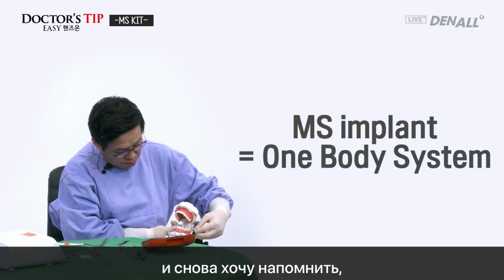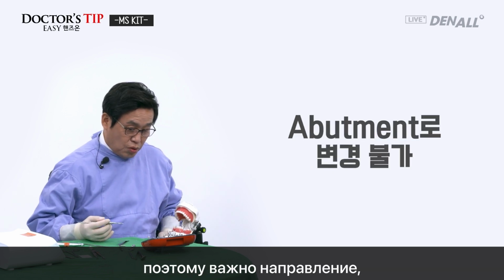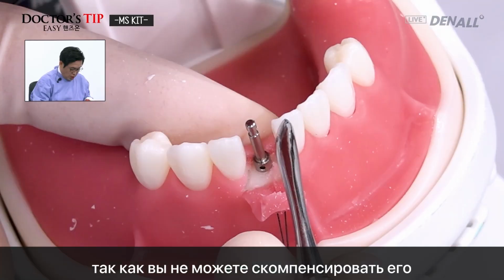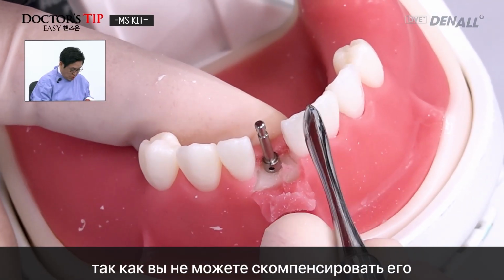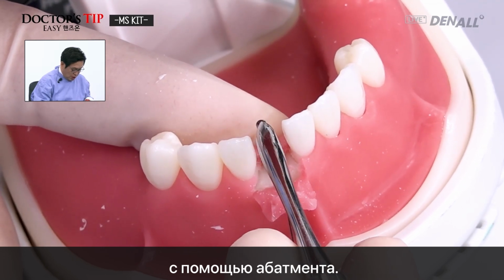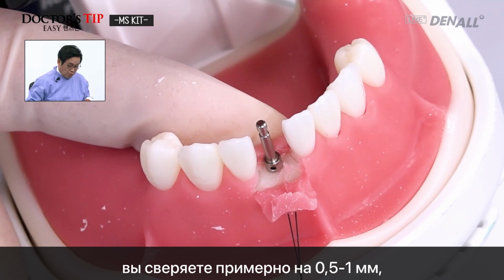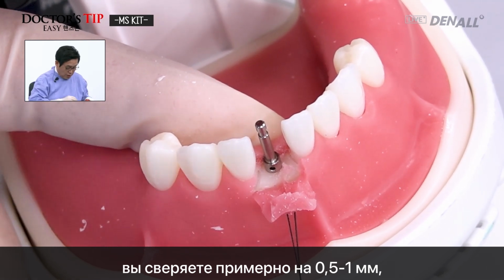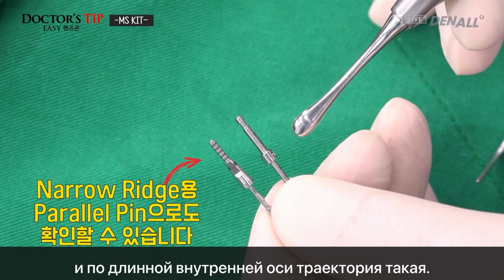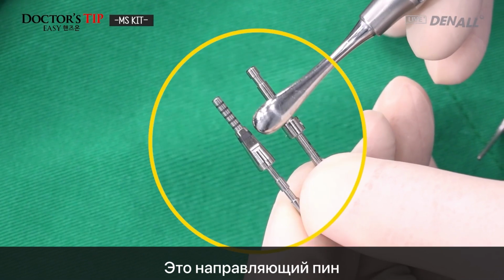And again, this is a one-body implant, so the path is important because you cannot change it with an abutment. And like this, in the adjacent teeth, you check against the incisal edge line. So about 0.5 to 1 millimeter, it's tilted toward the lingual, and on the longitudinal axis, the passage is like this, and this is the guide pin.